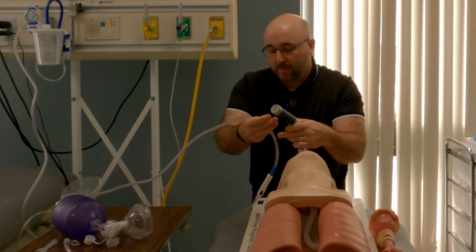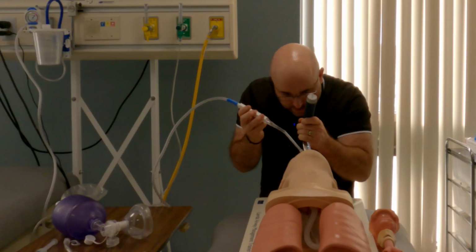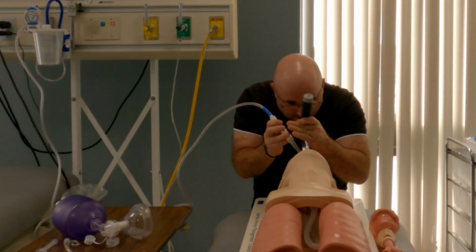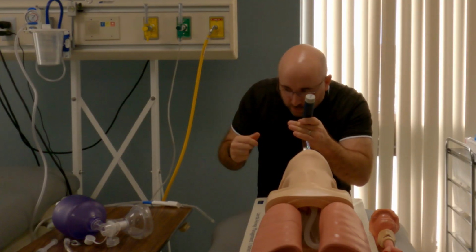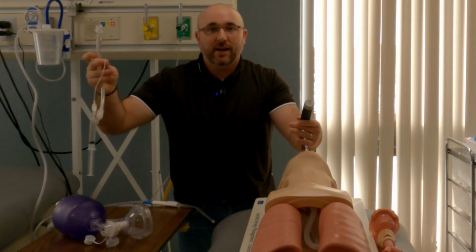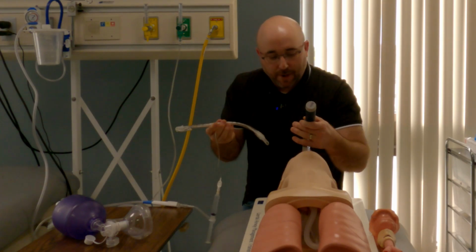That's one of our 5 items. The suction is handed to the person intubating. They can look, clean it out. Great job. Next thing I want to ask for is the endotracheal tube. So from this side, they're going to hand endotracheal tube, take it out of the package.